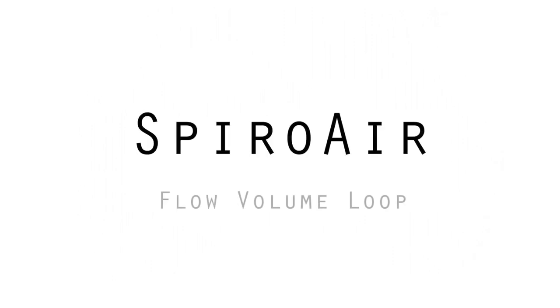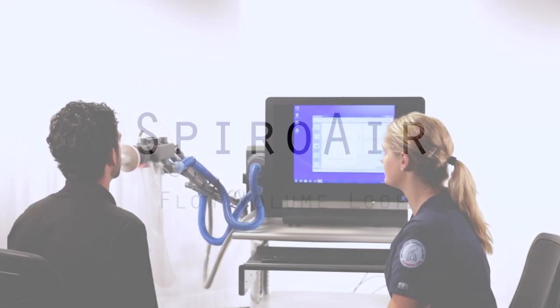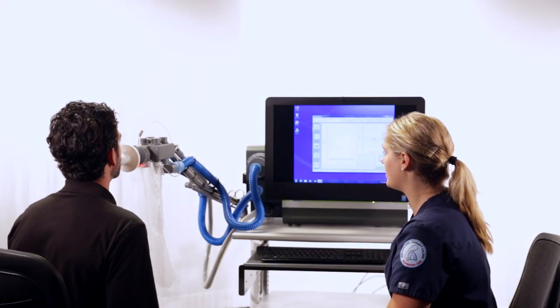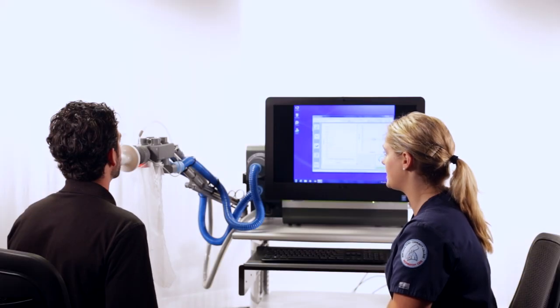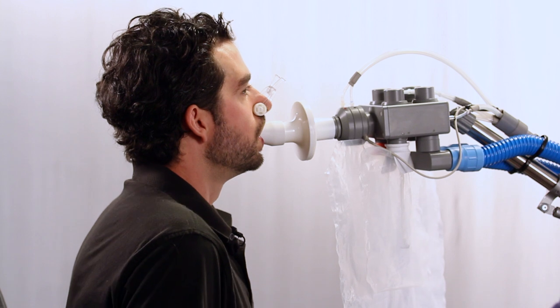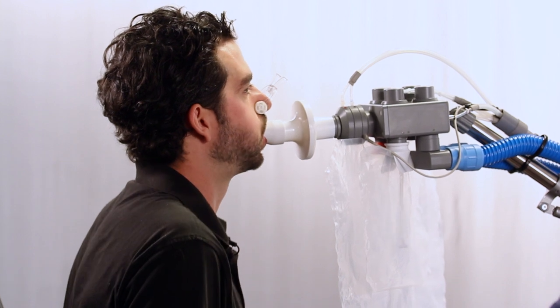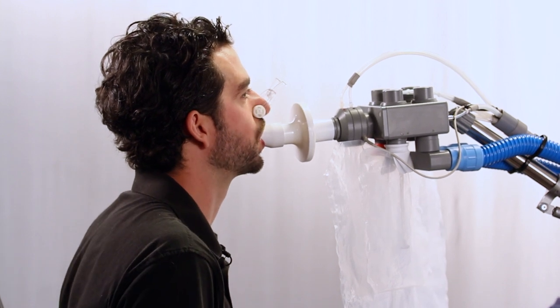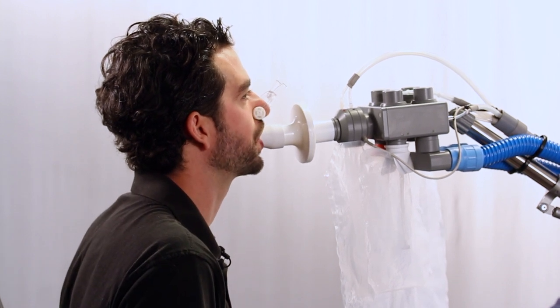Spiroair flow volume loop. Flow volume loops are the most recognized pulmonary function test, but they are the most demanding to perform and reproduce.